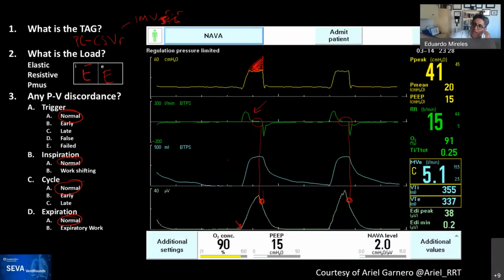The way that I understand this is, for example, when you move your arm and contract it, your neural signal is being manifested as a mechanical signal. But if I get to the end and I'm still contracting and the muscle is not, the signal is still showing, but there's no evidence of action on the muscle because it's not contracting. There's no displacement. Does that make sense?